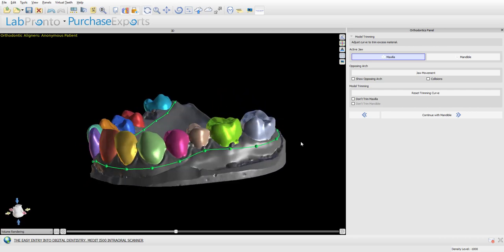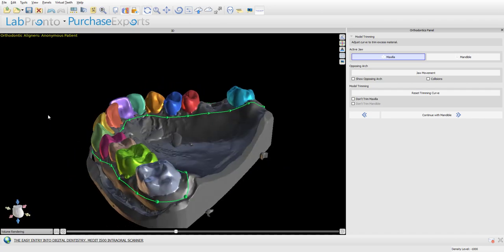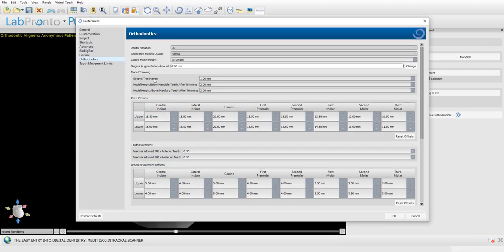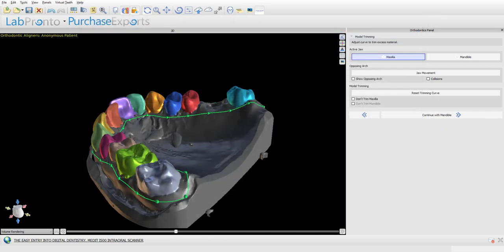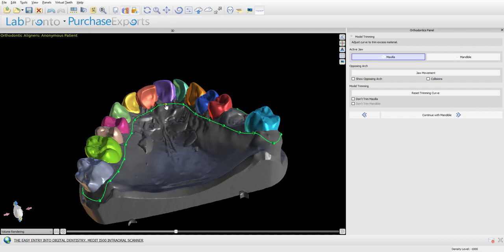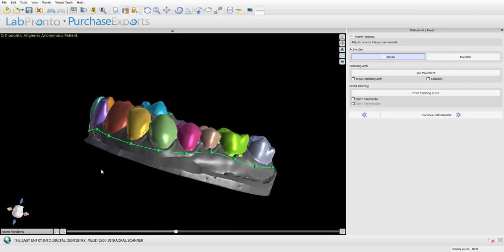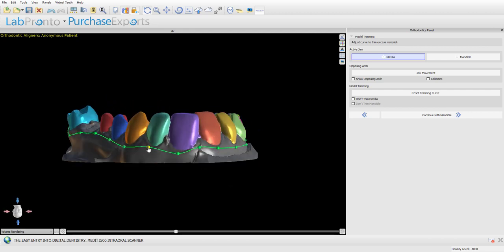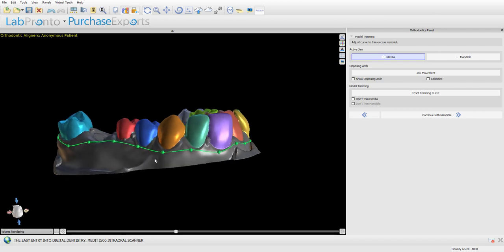We can review the curve and modify it if needed. The gingiva trim margin setting plus the model height below the mandible or maxilla after trimming together give us our total model height below the gingiva curve. With these settings we'll have three millimeters of model below the gingiva curve. If you want the model as thin as possible, reduce both settings to one millimeter each for two millimeters total below the gingiva margin. The closer the curve is to the gingiva margin, the more fine-tuning it may need.